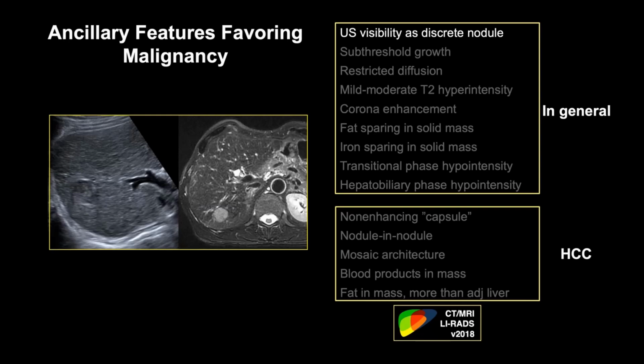Ultrasound effectively increases your pretest probability for the diagnosis of HCC at diagnostic CT and MRI if you find that exact same observation that you identified on ultrasound.